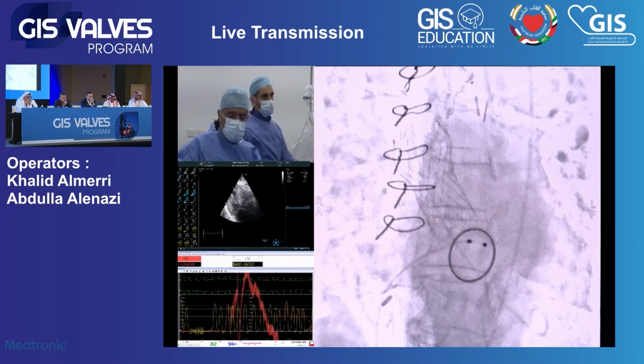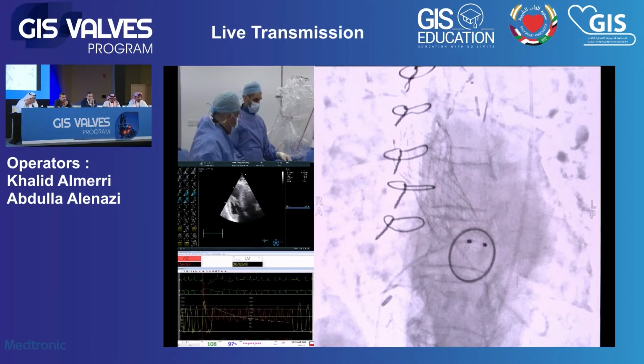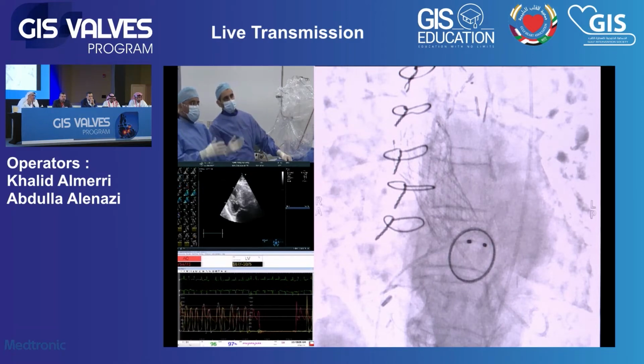And as I said, there are ways to evaluate your results. One is the gradient, and the other thing is to evaluate the aortic regurgitation, which can be done by angiography or echo, or evaluate your hemodynamics. And usually if you have significant AR, you will see your LVEDP goes up, and that's the advantage of doing a pre-procedure hemodynamics.